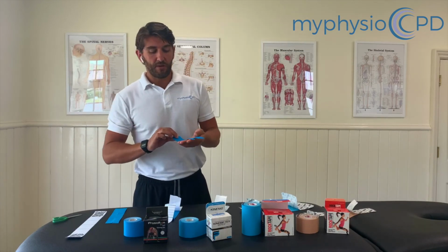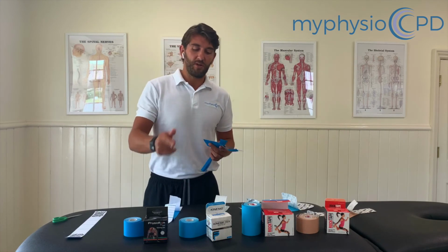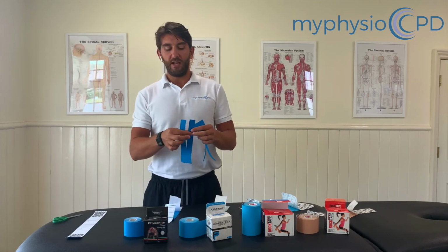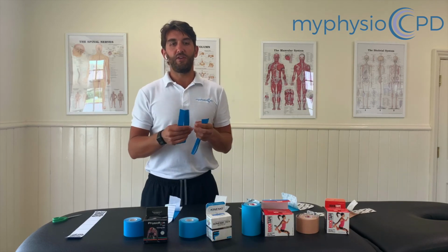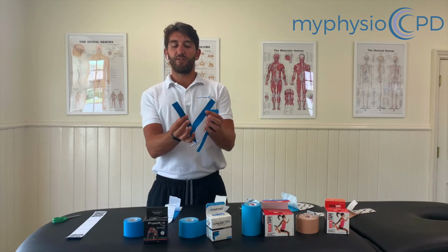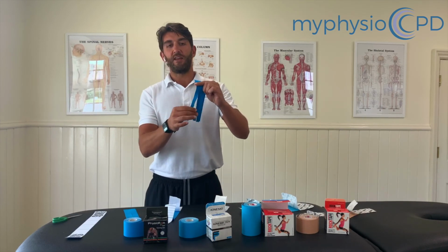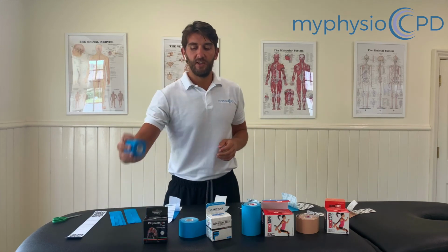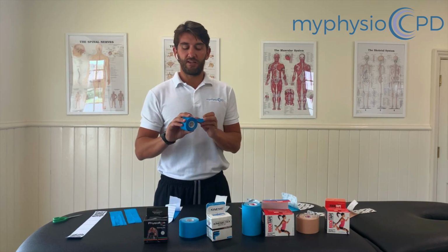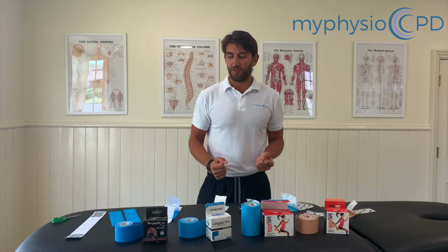So tapes come in different forms as well. Some are pre-cut, some come in a whole roll. But if you're lazy, you can get them cut into Y strips, and that's the Kinesio taping original technique, split the tape quite a lot. And then they can come also in fan taping. Like I said, the most common sizing is 5 centimeters by 5 meter roll. So yeah, there's all the tapes there for you.